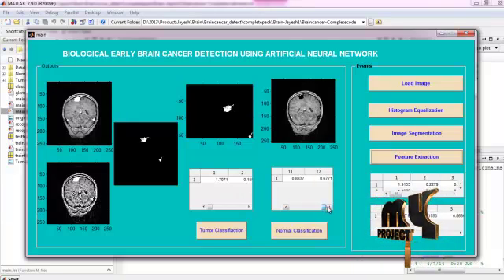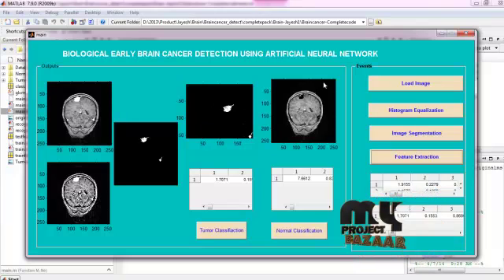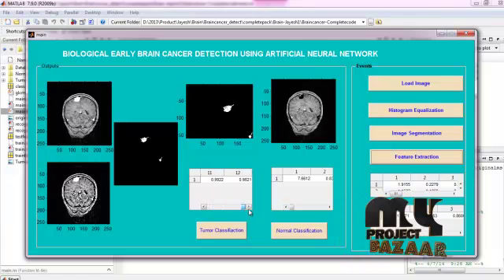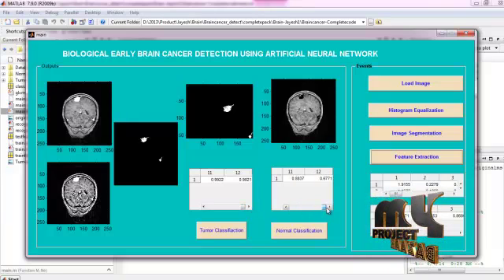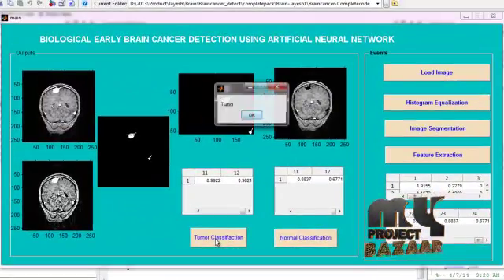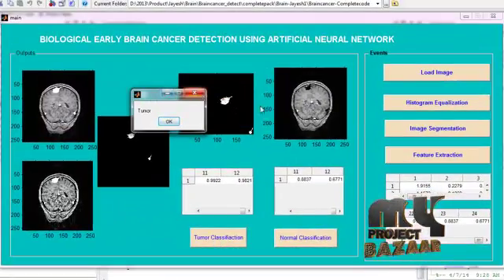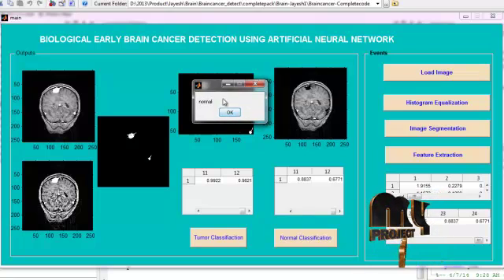Separately, tumor part position features and normal part features are extracted and arranged. There are 12 tumor features and 12 normal features, giving a total of 24 features arranged for the training image. If we pass the tumor part alone through the ANFIS classifier, it returns tumor features. If we pass the normal features, it returns normal.